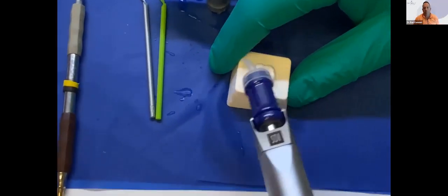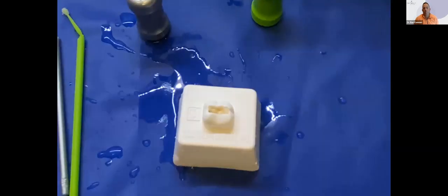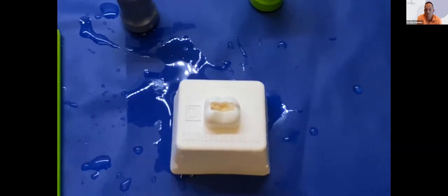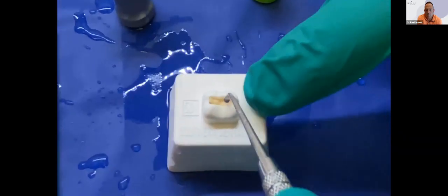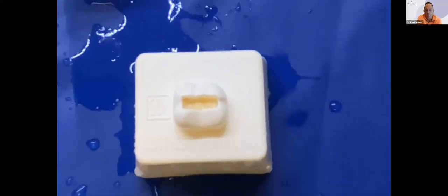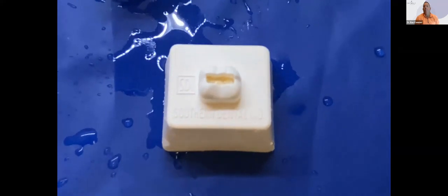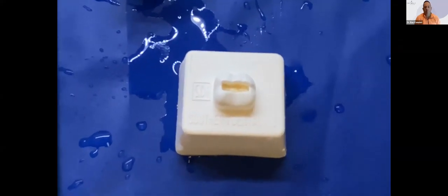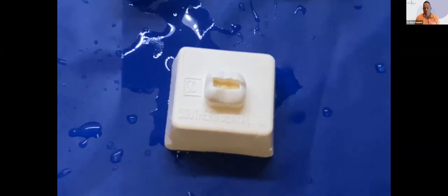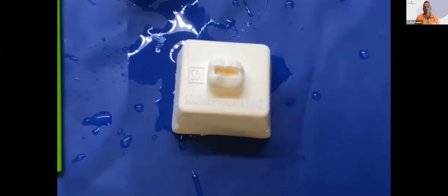So I'm going to apply a little bit onto the dentinal floor, just like so. I'm going to take a ball burnisher and wet it with a little bit of water, not alcohol, when we use glass ionomer, and I'm going to tamp that down right into place. You can see that as it tamps down right onto the dentin. And now we wait. We keep it dry and we let it sit. Riva will set pretty quickly, well under a minute. I'll check with my ball burnisher every so often on the consistency. I see it's still wet, but I'll press it down into place and we let it sit.